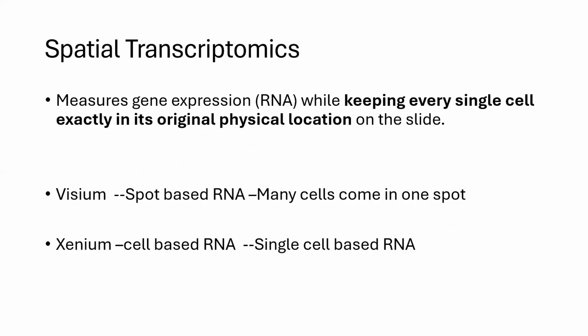And then people go for foundational models, which are working to get segmentation and classification. Suppose we have a biopsy that has some problems. Even if we know that all problems are due to genetic factors, can we understand what type of genetic expression is in a biopsy? Even now there are tools like Xenium and Visium. They are high-level scanners, and they cost huge money to use.